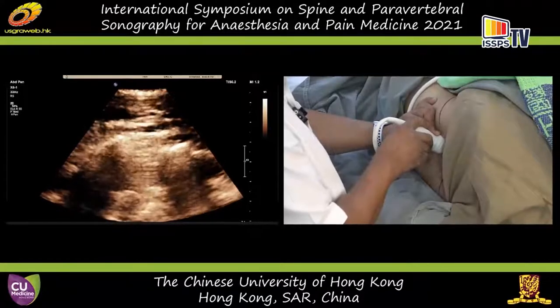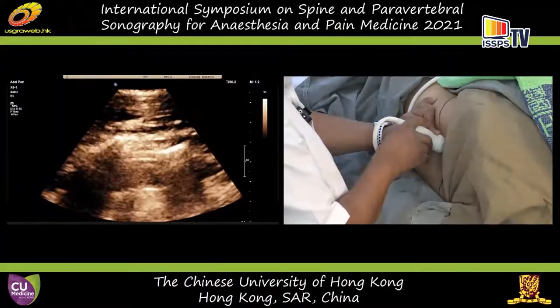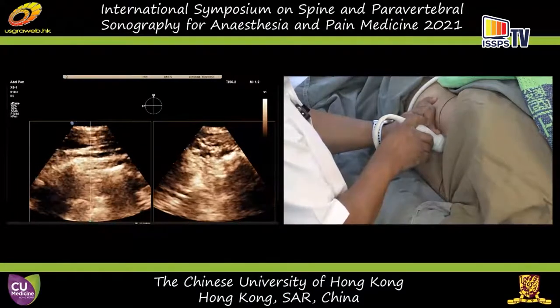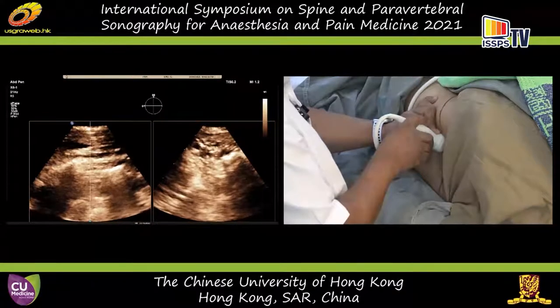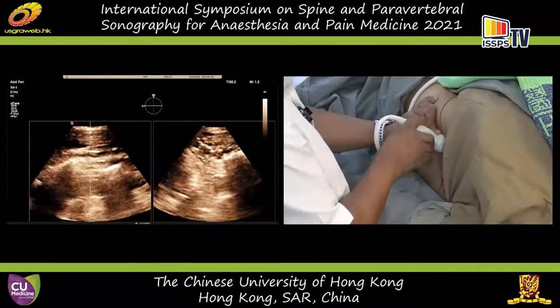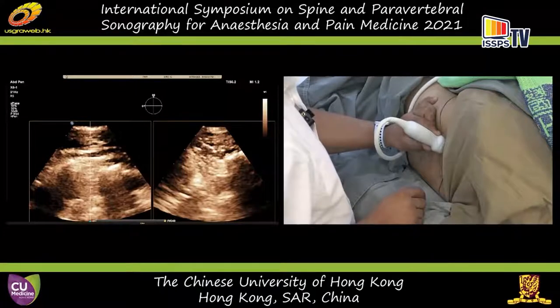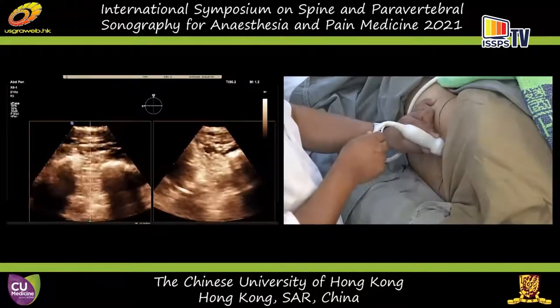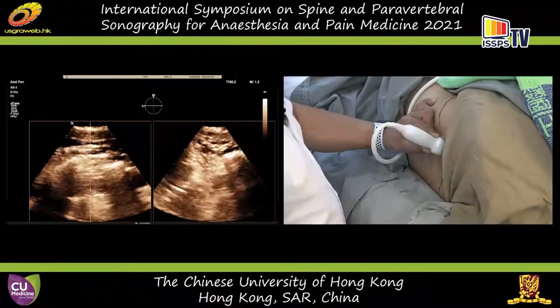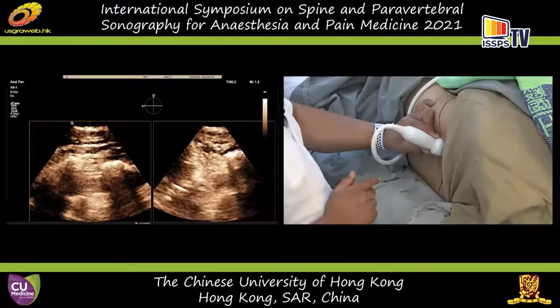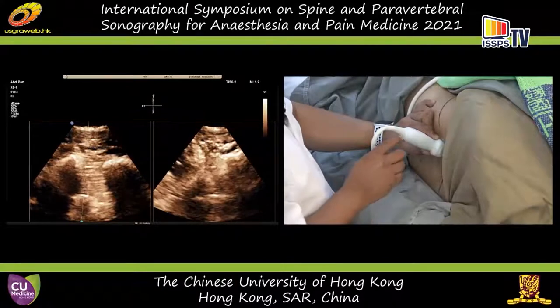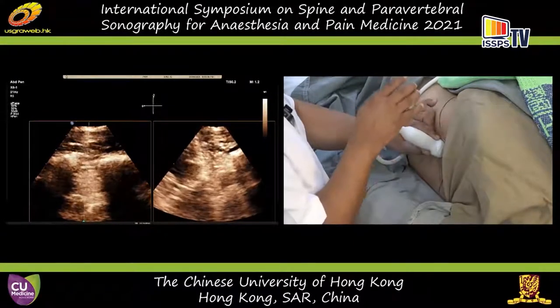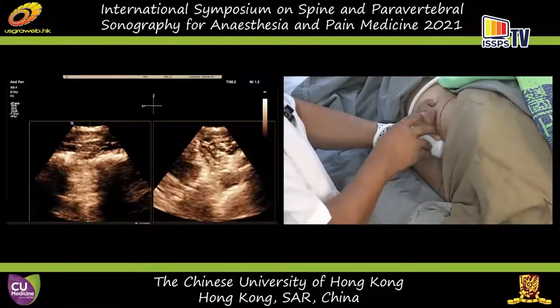I'd like to show you how you can use it to do biplanar imaging. Imagine the image to your left is our primary image — the sagittal image — and it has a line in the middle, which is the plane at which it is cutting the hemispinal view. I'm doing a right paramedian sagittal oblique scan. You can see the angle of the transducer is a little bit oblique so that I can insonate the dura well. As you move the central line left and right, the image on your right changes — it is changing the transverse view. This is not the entire interspinous transverse view; it is just the hemi-view of the transverse view on the right side.